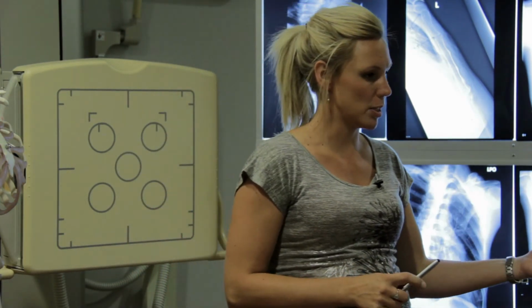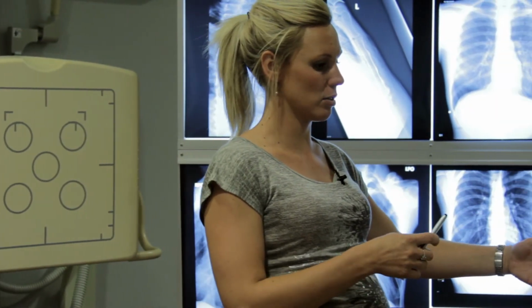Sponges, I know sometimes when we do patients on the table and you roll them up into those obliques, we stick a sponge under there. Make sure it's an appropriate sponge that isn't going to show artifact. Don't wad up a pillow or a blanket. Use an actual positioning sponge.